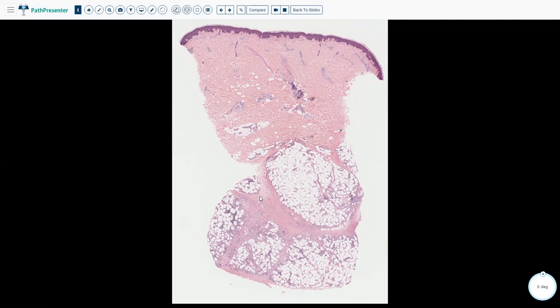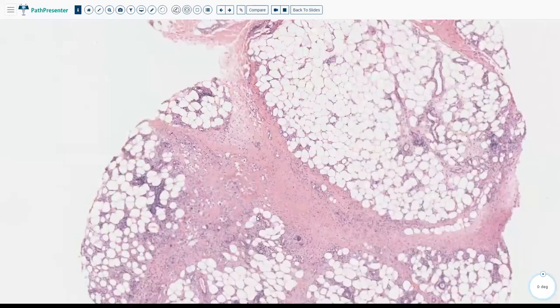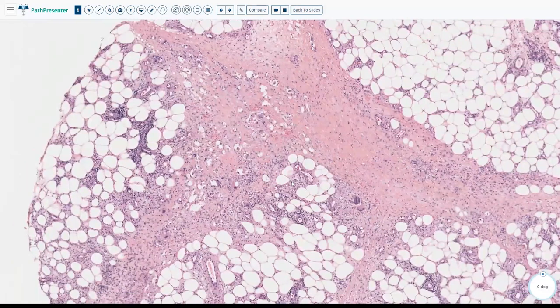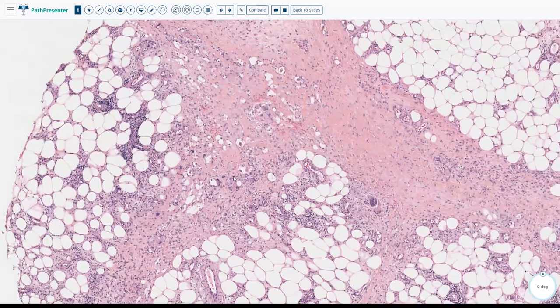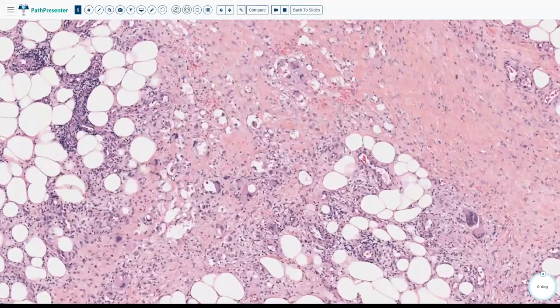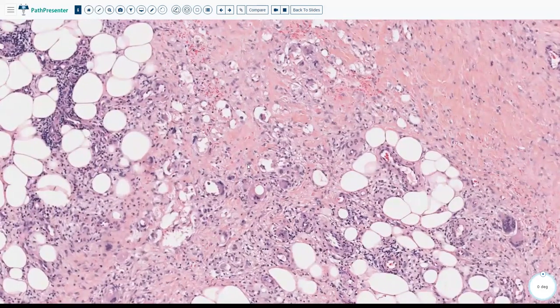The septa are quite thickened and fibrotic compared to the thin layer of septa seen in normal skin. At high power, there is a lot of acute and chronic inflammation in the septa, with a lace-like inflammation going into the outer part of the lobules only. This inflammation is composed of lymphocytes, giant cells, macrophages, and shows granulomas known as Miescher's granulomas.